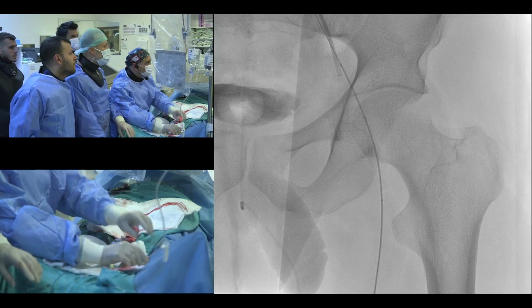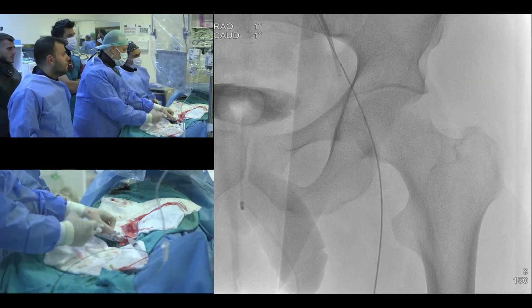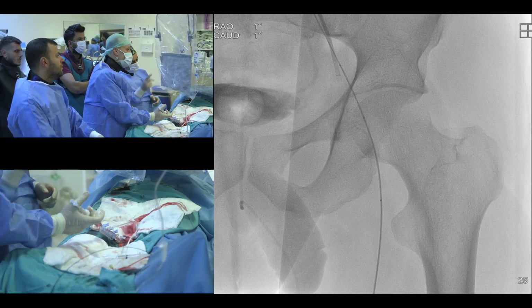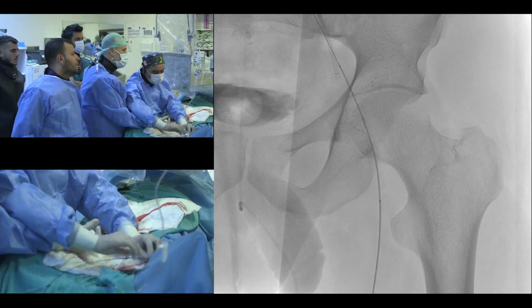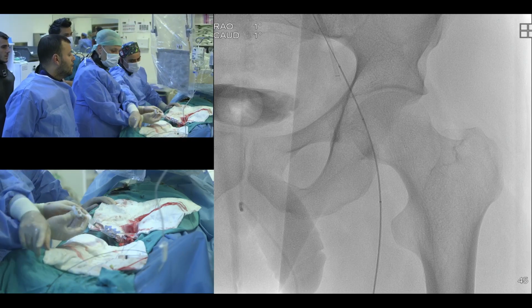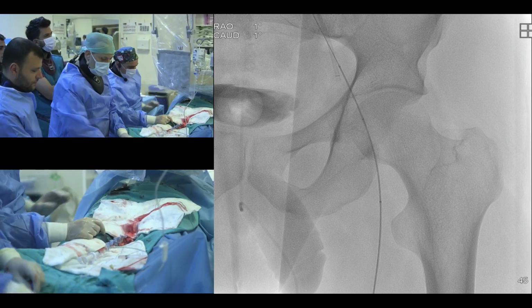Geçtiğimiz için miydi? Bak, bekle. Alabiliriz. Tamam. Ben şimdi teli şeyin içine sokacağım da lümen kontrolüm teli çıkalım. Buradan tersten veririz. Teli çıksa, teli alabiliriz.